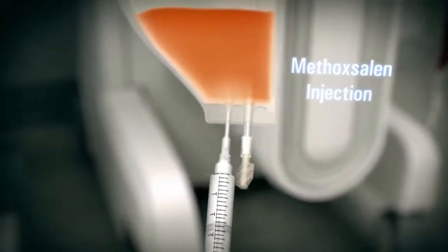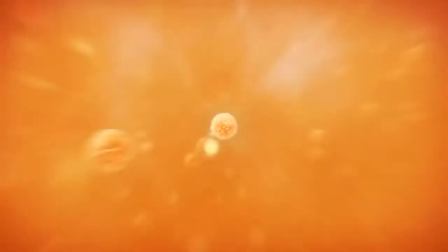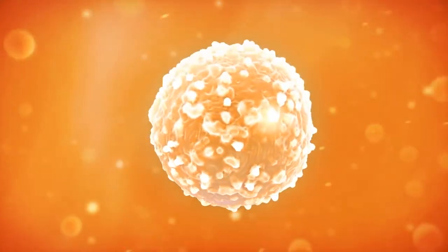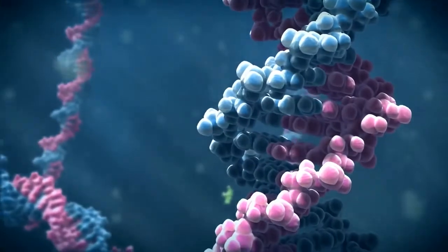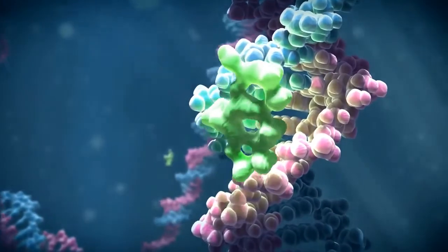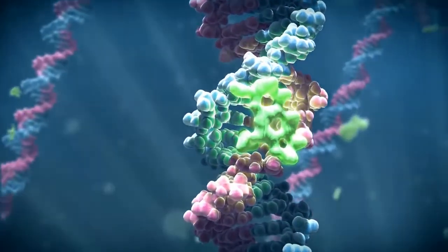With the desired level of buffy coat in the treatment bag, methoxalin is injected into the bag. Methoxalin is a photoactive substance which targets the DNA within the cell and when bound to it forms single and double-stranded cross-links which ultimately program the cell for apoptosis upon photo activation.